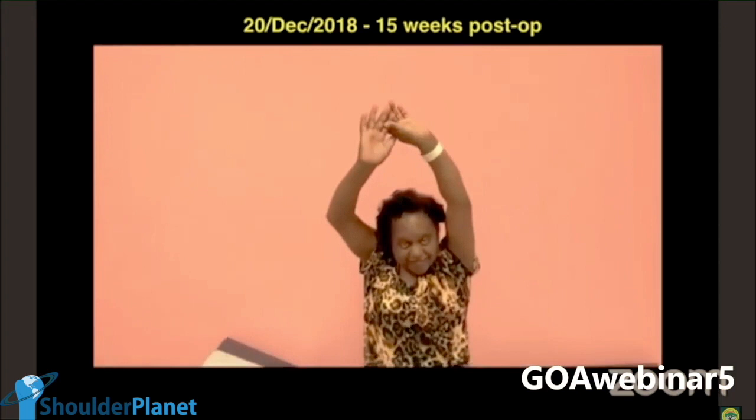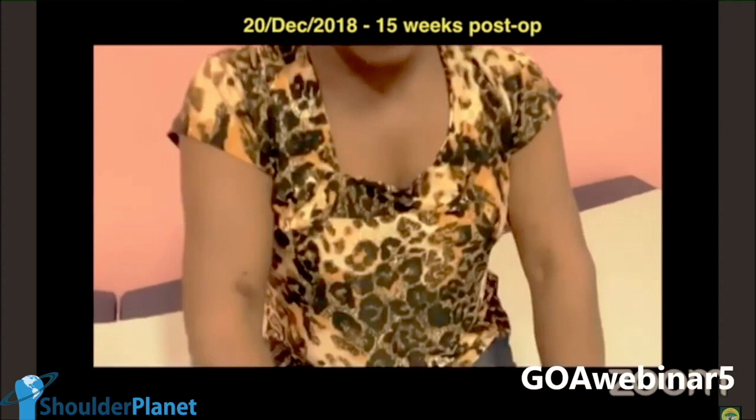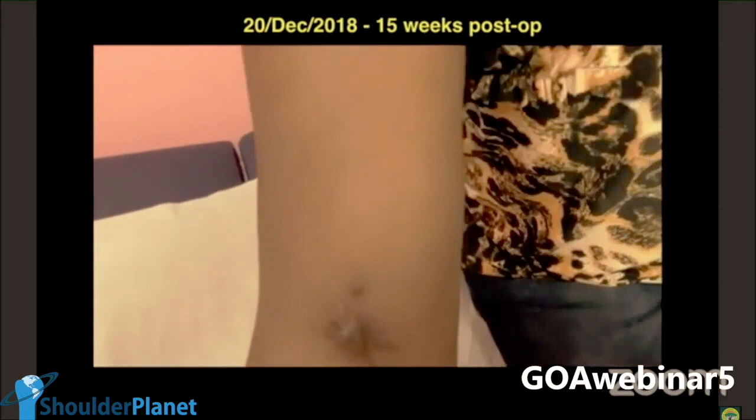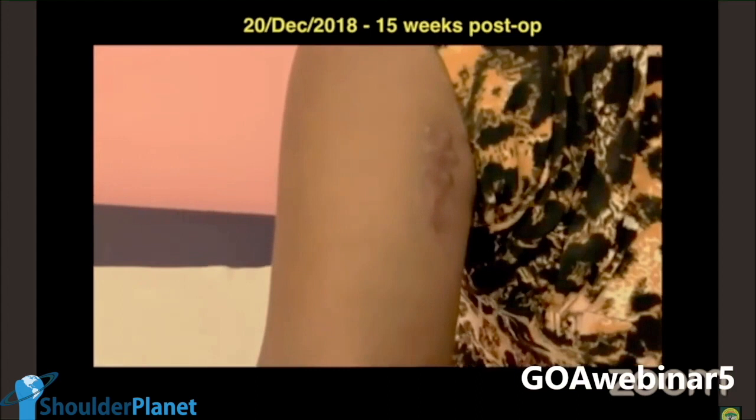Let's see the size of the scars. As I have said, there is a phenomenon in which you have a shrinkage of the skin. So it's very short, very small. This is again in the delta-pec line. There is no problem with the musculocutaneous nerve.